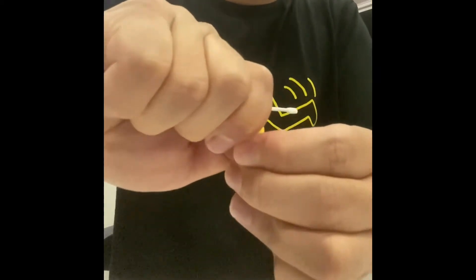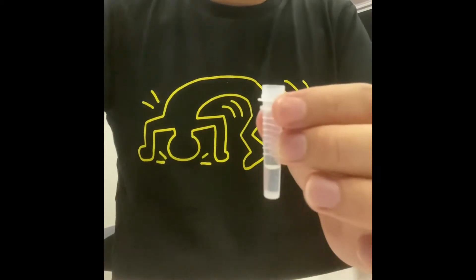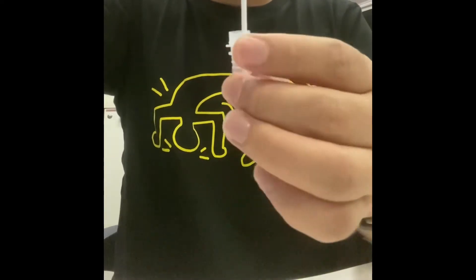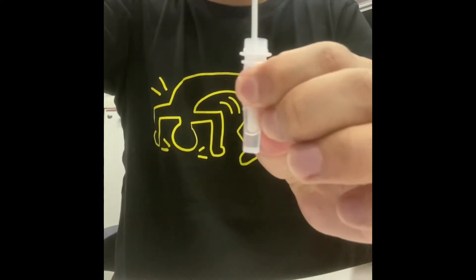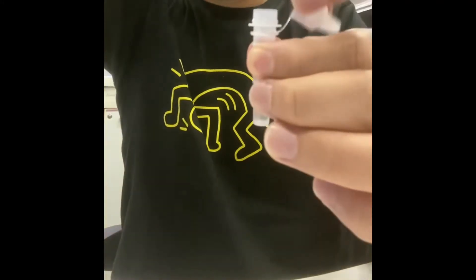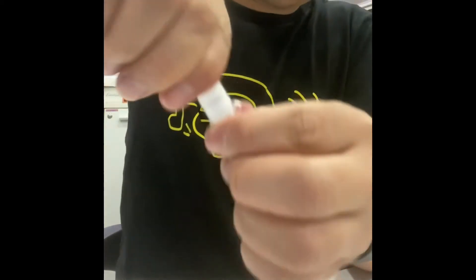After that, open the test tube and immediately insert the swab sticks into the tube. Then take out the swab stick and close the cap of the tube firmly.